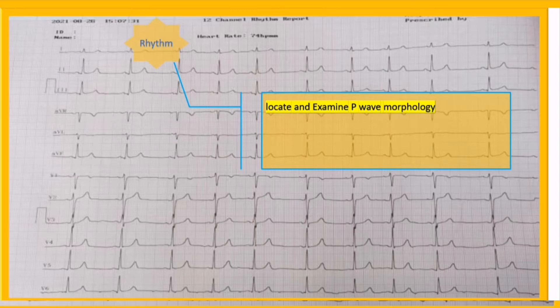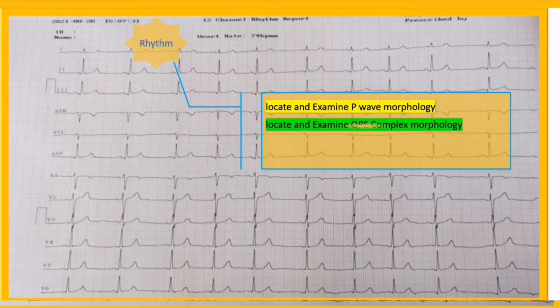Remember that sometimes P waves are buried within QRS complexes and T waves, which makes it very difficult to mark them properly. In such cases, it is highly recommended to scrutinize all 12 leads to look for evidence of P waves and atrial activity. Second: locate and examine QRS complex morphology.